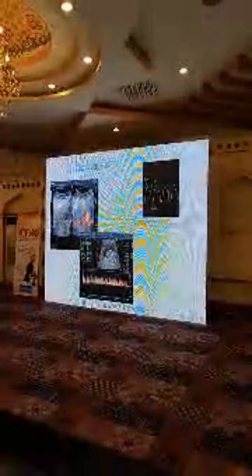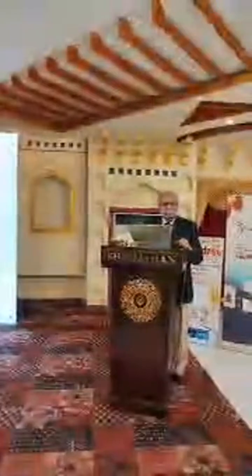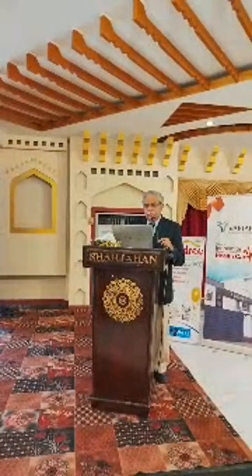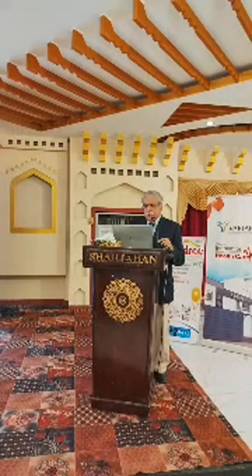So this is the ductus venosus flow. You have 2 upstrokes and 1 downstroke. So this is characteristic of ductus venosus flow. This is also characteristic of pulmonary venous flow. So if you're looking at the pulmonary vein, you will find that the characteristics of the pulmonary veins are very similar to the characteristics of the ductus venosus.